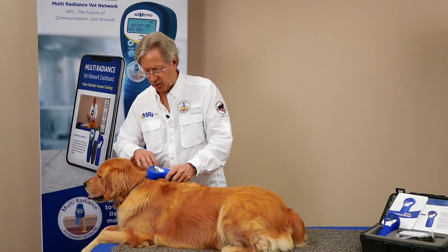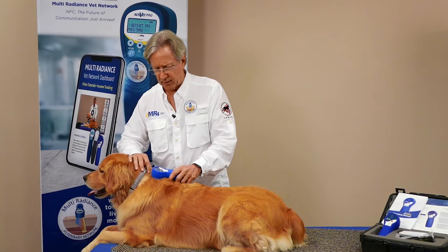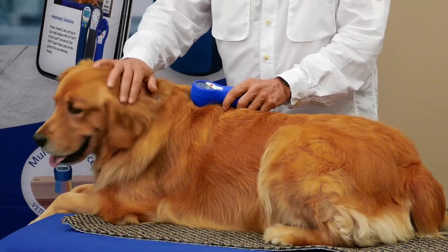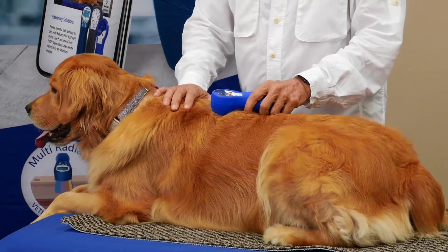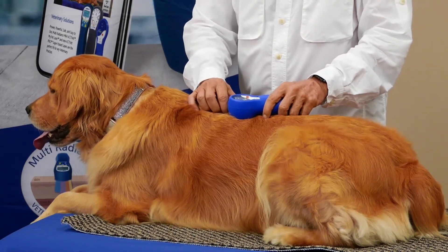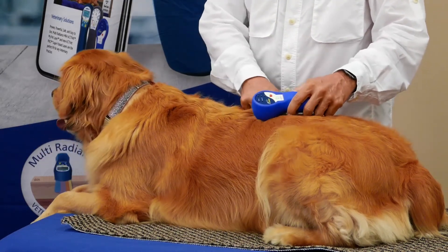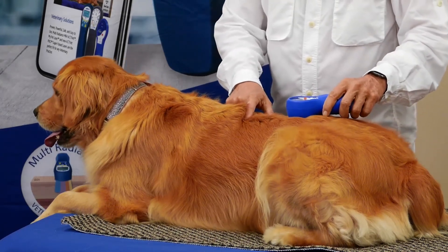We're going along the nerve roots of the spine in this unwind protocol, moving nice and slow. This is an automatic timer for five minutes. As you can see, we're not causing Tango any stress or anxiety — she's perfectly calm. I'm distal to the midline just a little so I get the nerve roots, because we don't want to go along the bone of the spine itself.